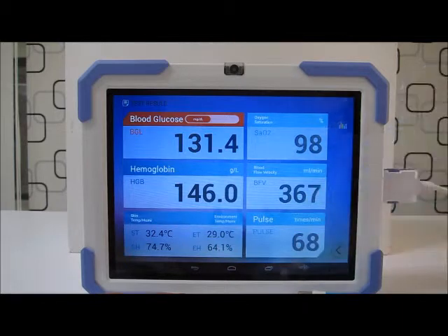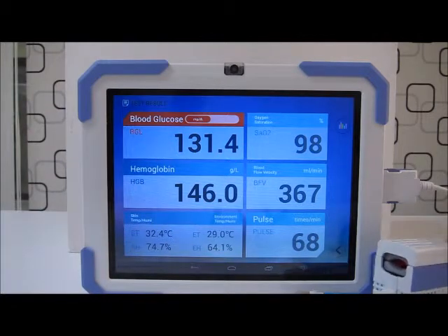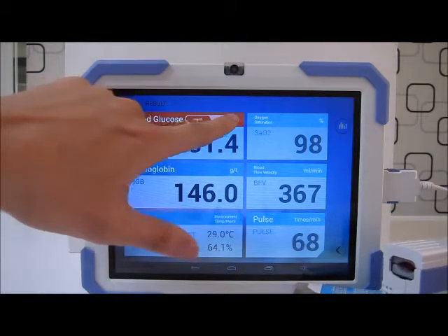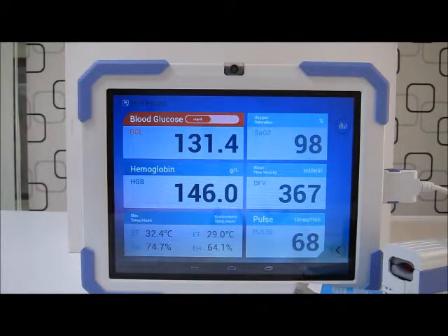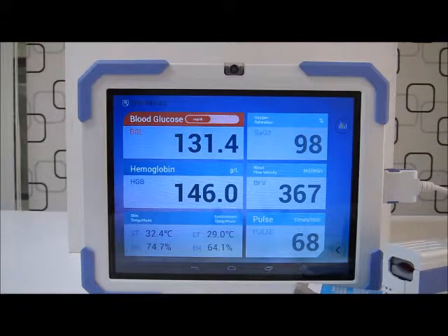Our test result is out — I can remove my finger. My blood glucose is very high, so it is highlighted in red. The rest of my health index — hemoglobin, saturation of oxygen in the blood, blood flow velocity, and pulse — are actually okay.